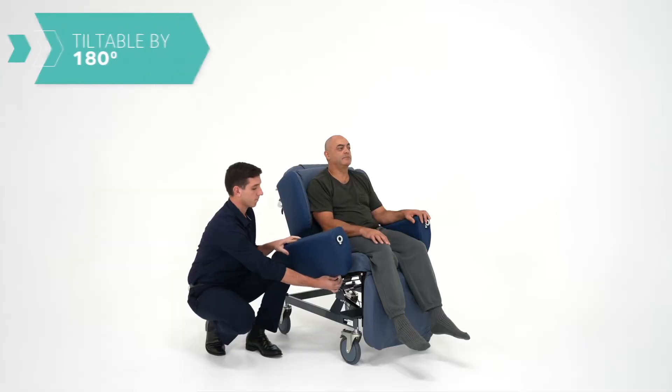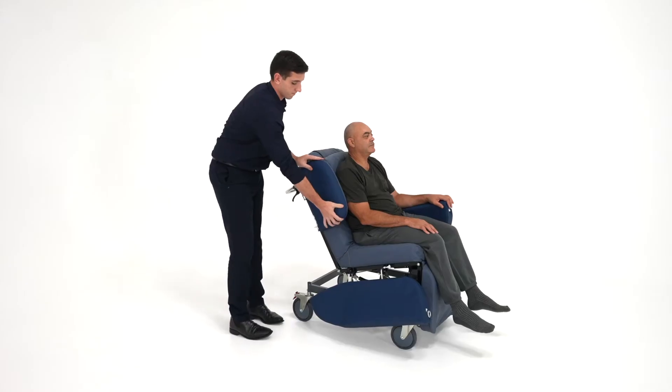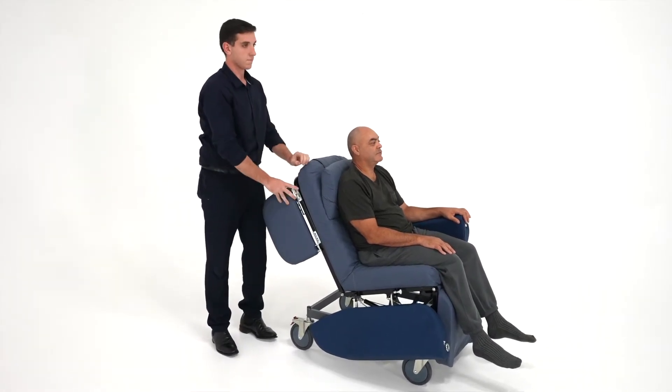It has many features that consider the needs of both the carer and the user of the chair, so let's check out a few. The Regency armrests, also known as the wings, fold away 180 degrees from the side of the chair. This is one of the Regency's biggest advantages as it allows easier access to the user.